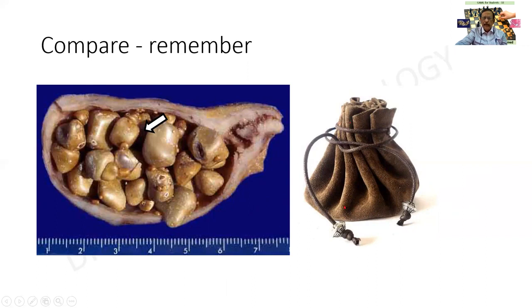This is a pouch. There are different kinds of containers. One is a pouch or a bag that an old lady carries for keeping her cash. It has exactly this kind of appearance, so it is described as sac-like.